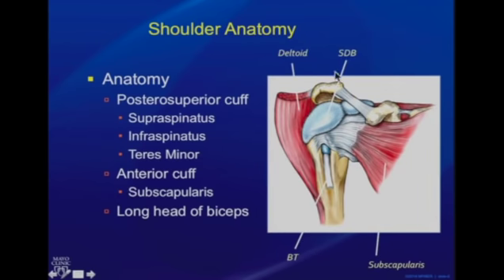If you cut out the biceps tendon, then under the acromion you can find a virtual space that is a subdeltoid bursal space. And additionally, you can look at the subscapularis tendon as it comes and traverses the bicipital groove wherein lies the biceps tendon. We are going to look at anatomy in a little bit of a detailed fashion here.